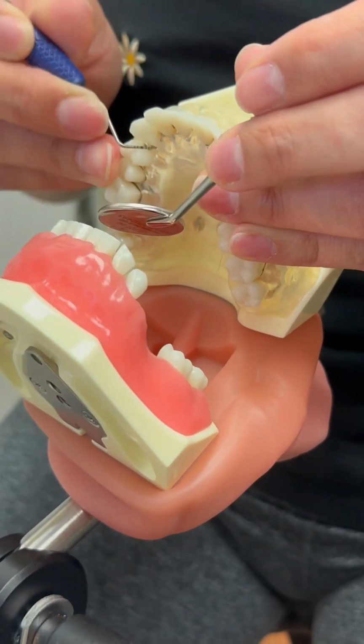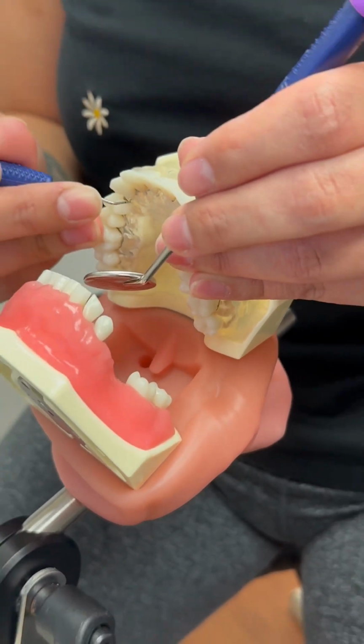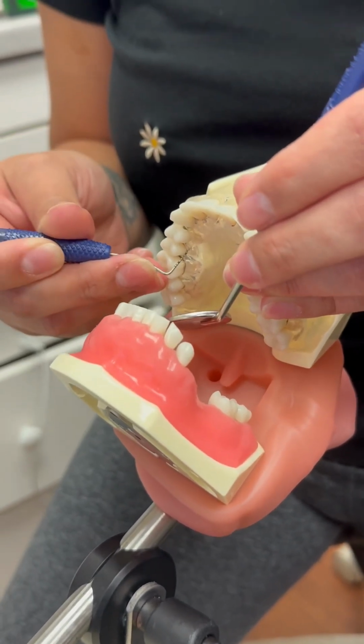With this instrument, we use little strokes, and we use light pressure until the junctional epithelium is blanching.